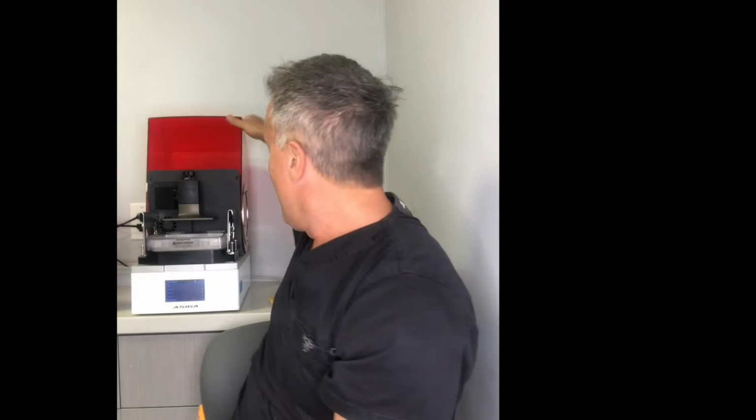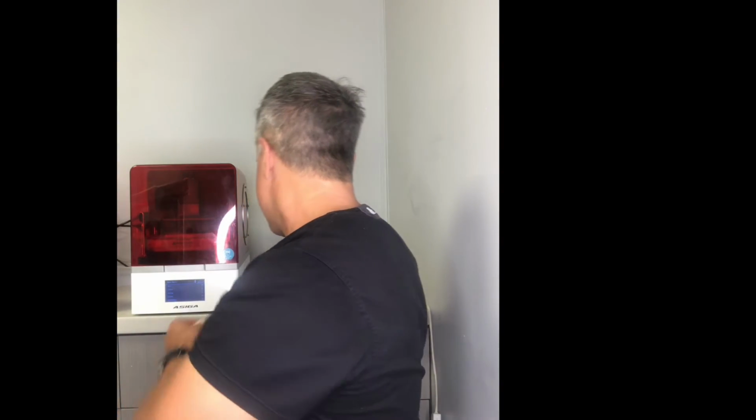So the Asiga printer can use that. It can use the Nextdent resins. They also have their own line of Asiga resins. The one thing that's interesting when you are evaluating bridges is to be careful of companies making a bridge that has a lot of spacer. This bridge has a ton of spacer in it, and it's going to fit really any model that you make. So my test is a little bit better.